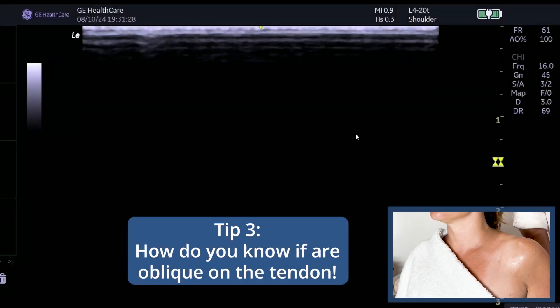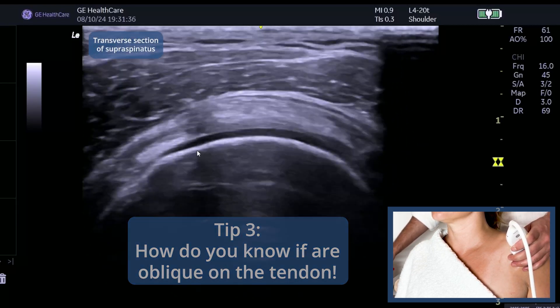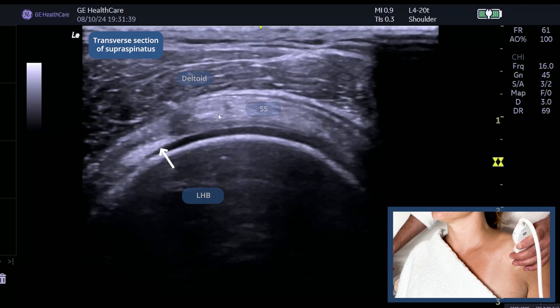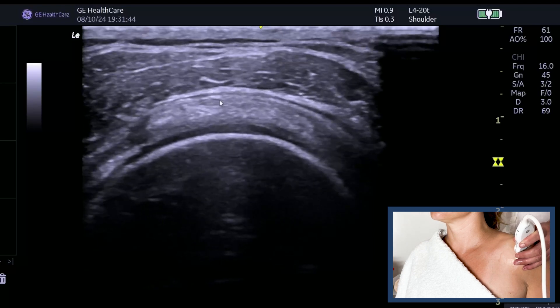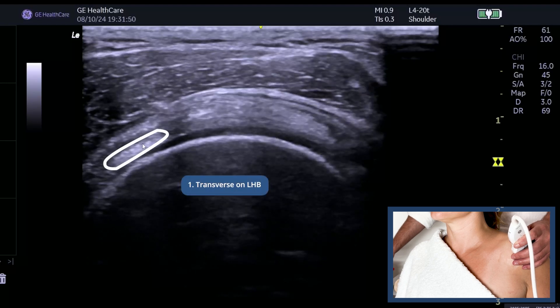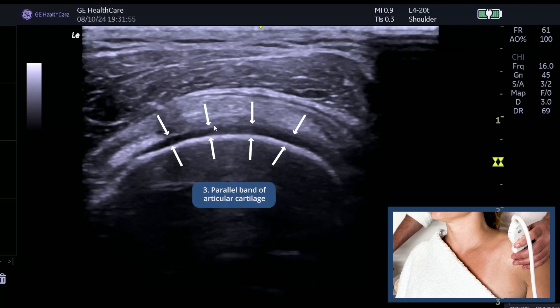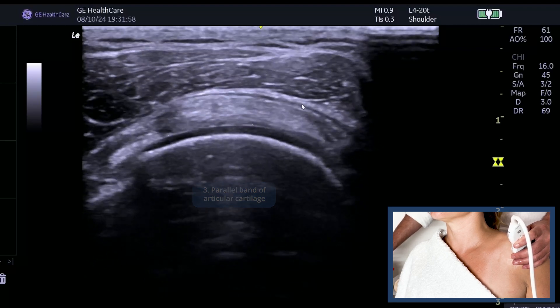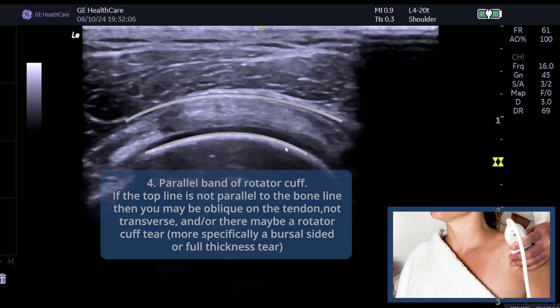Finding rotator cuff tears can be difficult — here are a couple of tips for when you're looking at supraspinatus. This is a transverse image of supraspinatus — we know that because we've got the long head of biceps here. This is the anterior aspect of supraspinatus and you can see infraspinatus coming up here. How do I know this is a true transverse? Number one, I've got a nice transverse image of the biceps. Number two, the bone is bright. Number three, I've got a nice parallel band of articular cartilage and a nice parallel rotator cuff relative to the humeral head.